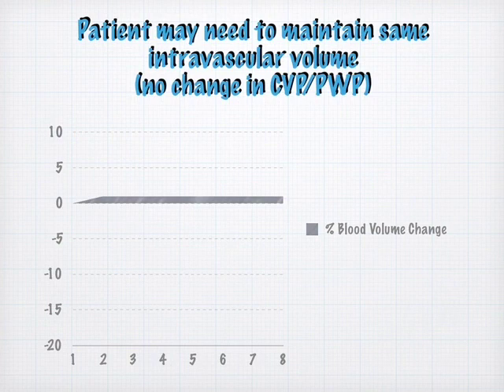I remove 4 or 5 liters all the time, oftentimes with the help of albumin. But the point is that if I did give something like albumin, for example, then I could turn up the fluid removal rate, and I could remove fluid at that rate that it's being recruited, and have some time left over by the end of the run when the recruitment is kind of stalling out now from the albumin, to make sure that they're maintaining their volume and that they're doing well.